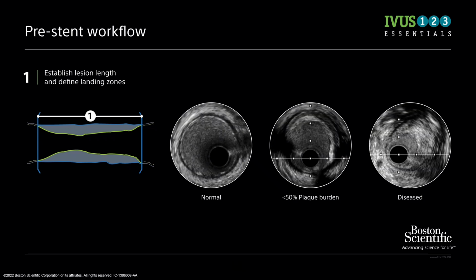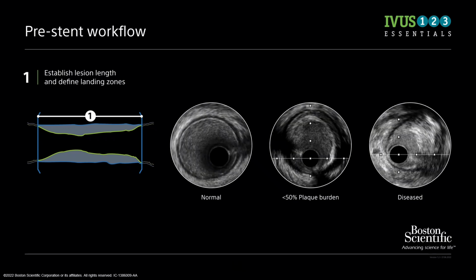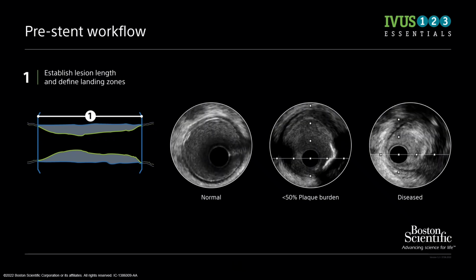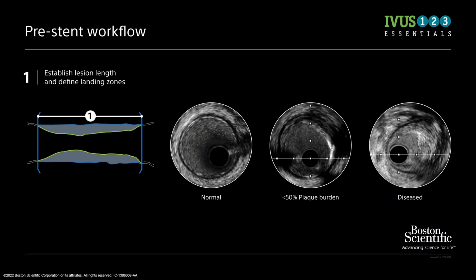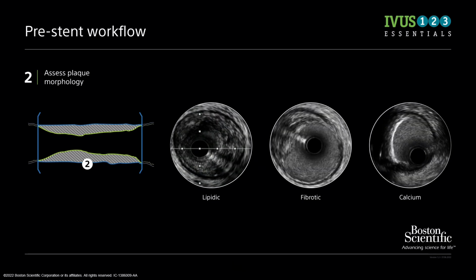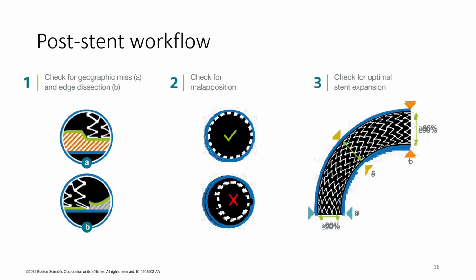You will be able to see video visuals of how this IVUS is working. You will be able to see the diameter of the blood vessel as well as how it is stenosed. You can also assess the pre-stent as well as the post-stent status of the artery. If you place the stent, whether it is working and the placement is correct or not can also be assessed by using an IVUS machine.